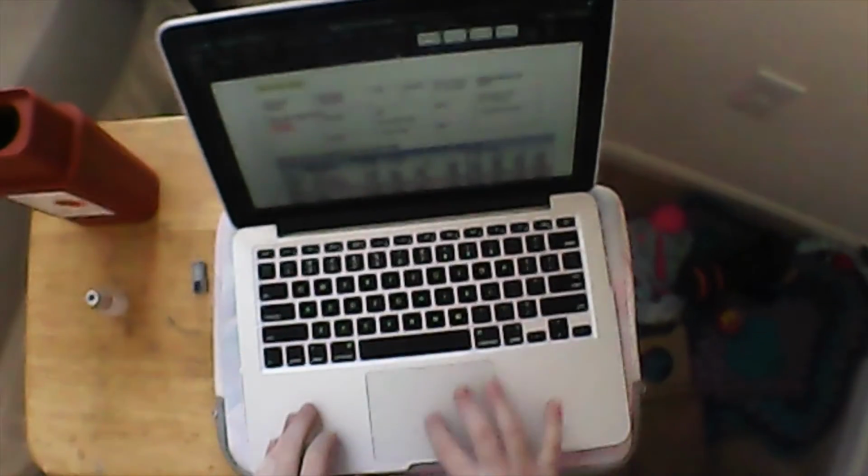I'm going to throw away the rest of the materials. Take off my gloves correctly. Throw them in the garbage. Hand hygiene. Go over to my MAR, and I'm going to initial, and I'm going to type in my site of administration. Perfect.